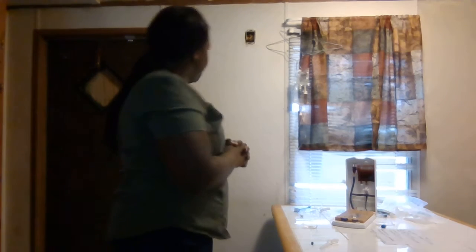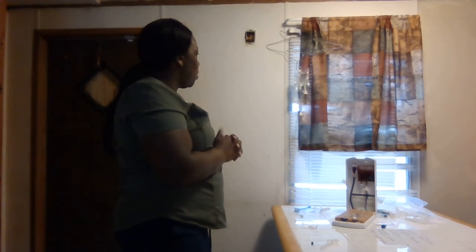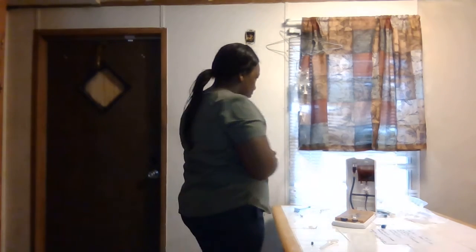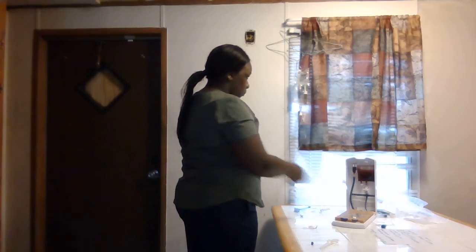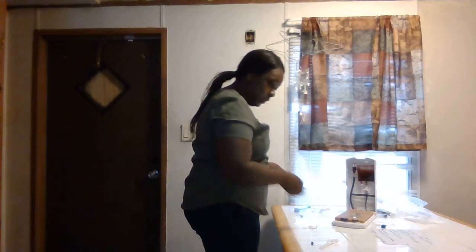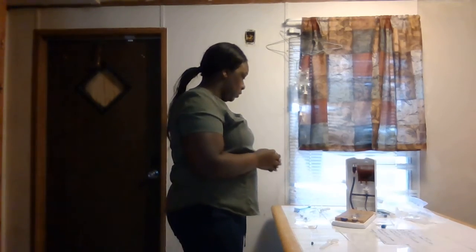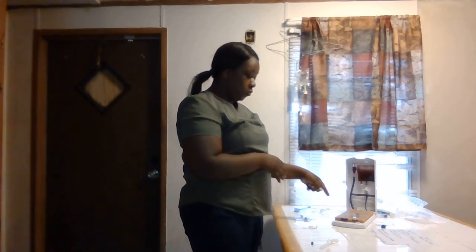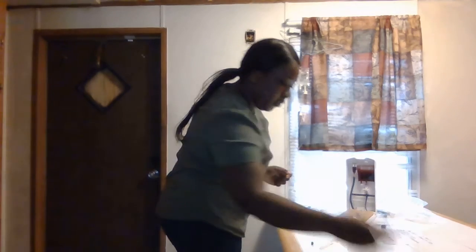I would put my pump on hold, disconnect my IV tubing and always apply a dead end cap. You're going to clean off my extension ports with alcohol for 60 seconds. Allow it to dry. Then we have to flush it.